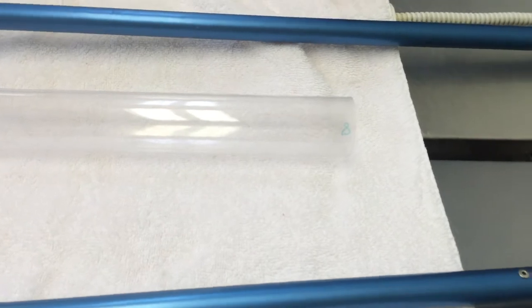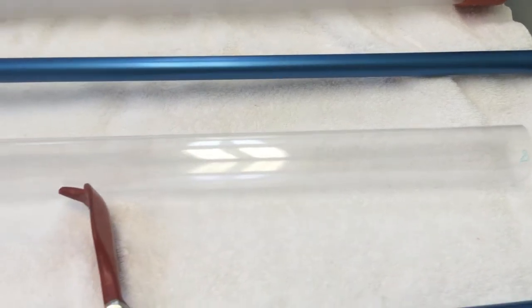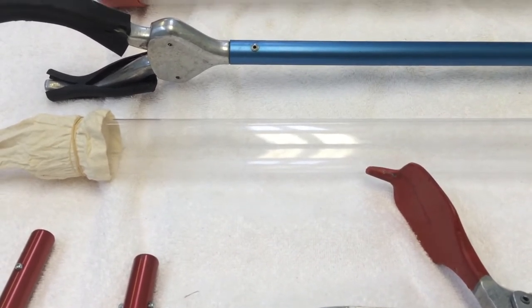This particular snake was actually hit by a car. Rumor has it a lot of blood was coming from the mouth. They think it was hit in the head. So we're going to sedate it, get some x-rays. It doesn't look too injured as close as I've gotten so far. No, I've not gotten him out yet.